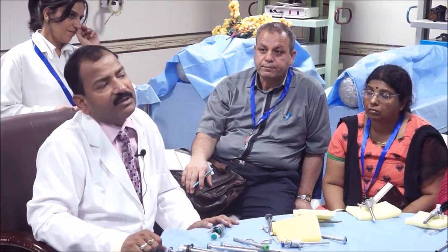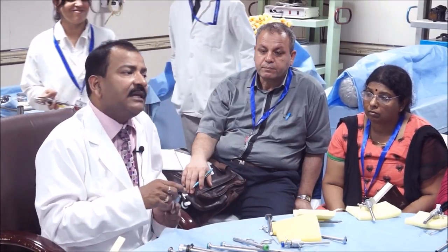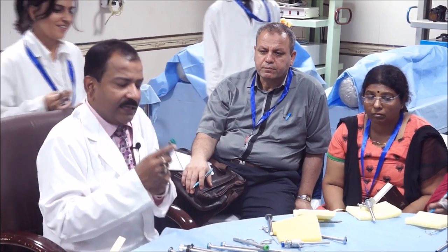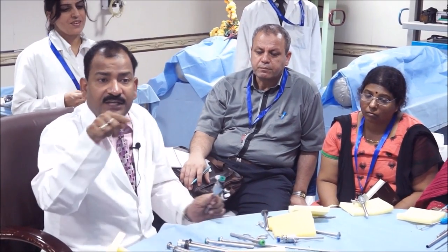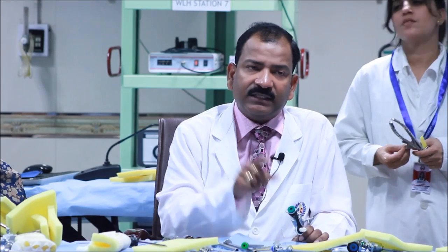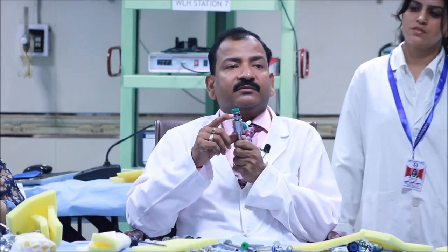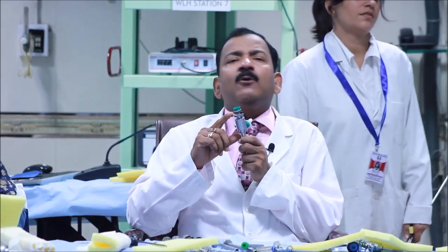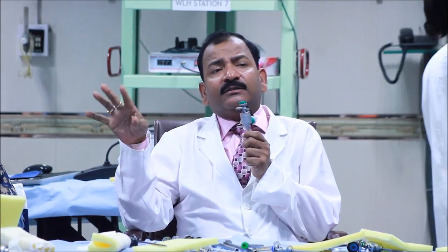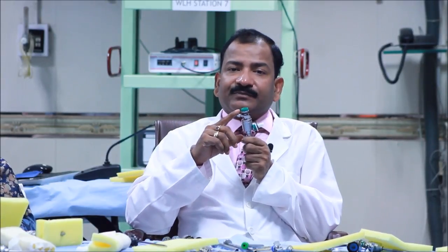Very good. Another possibility? Maybe from the washer itself. Maybe the washer. Another is the valve, the seal of the valve inside. So how will you know whether the seal of the valve is leaking or the washer is leaking? No, changing means you have to change 8. Suppose 4 ports are there, then change 1 washer and 1 seal, that is 2 per port, so from 4 ports you will change 8. That will take 80 minutes. Changing will take time.